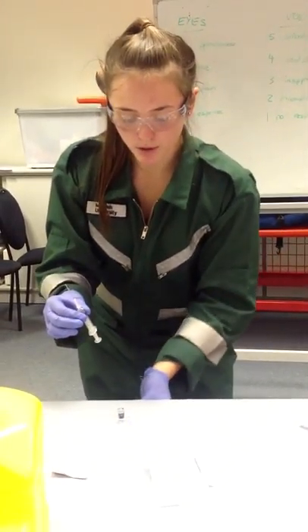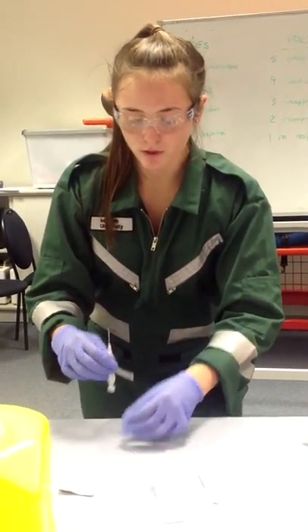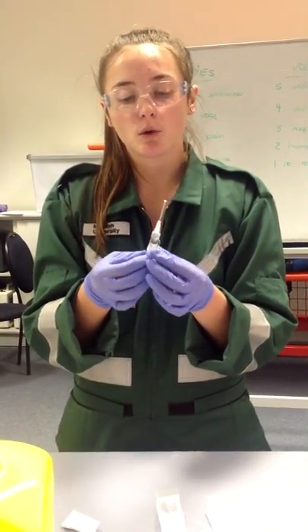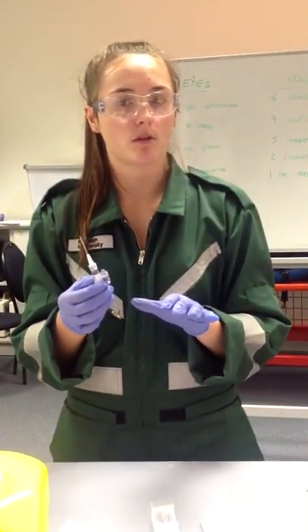I'm then going to tape this bottle to the syringe, so that if my partner checks for it or if I go to reuse it, it's all confirmed as the correct drug. I also checked this with my partner to make sure it was right as well.